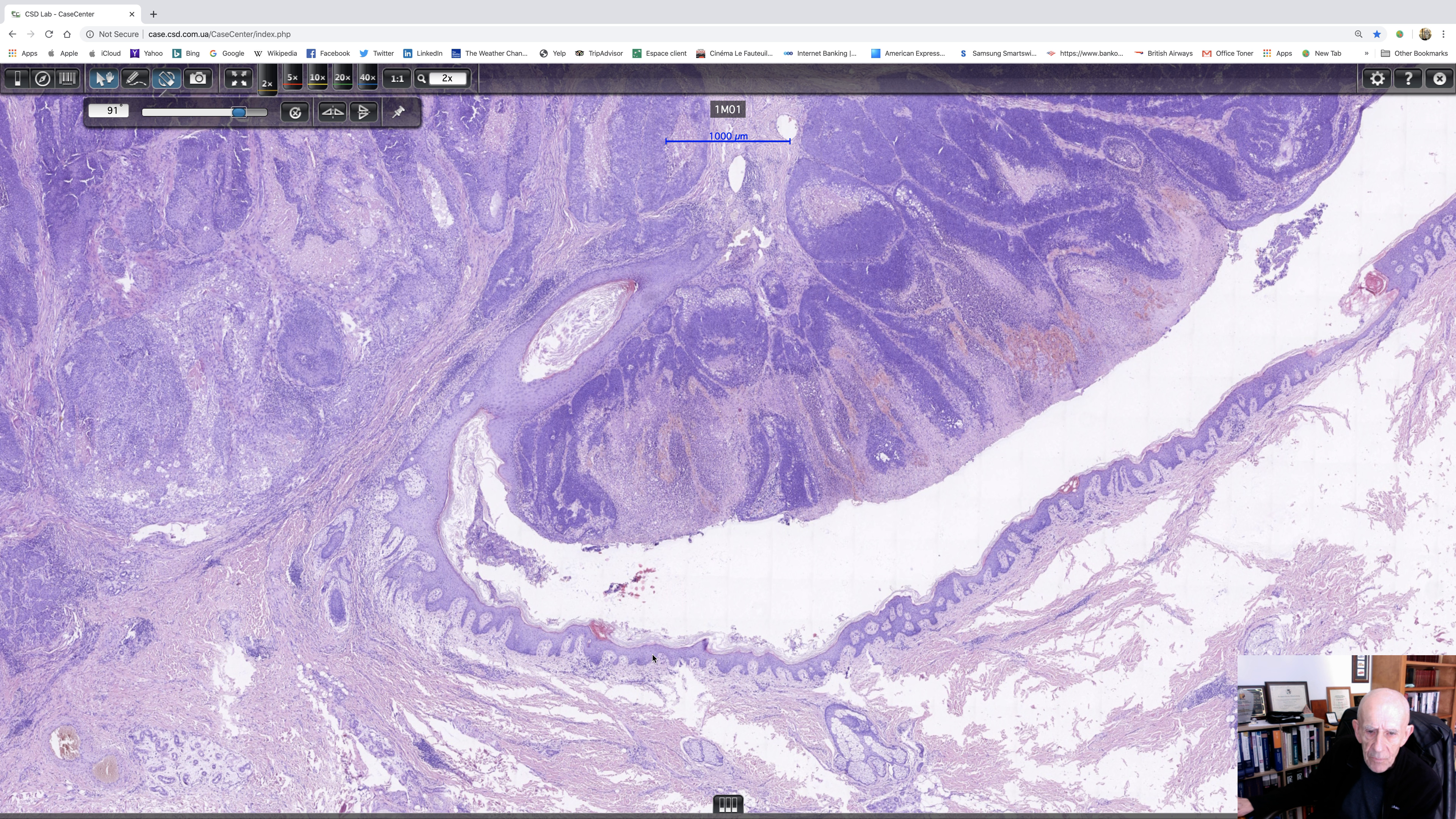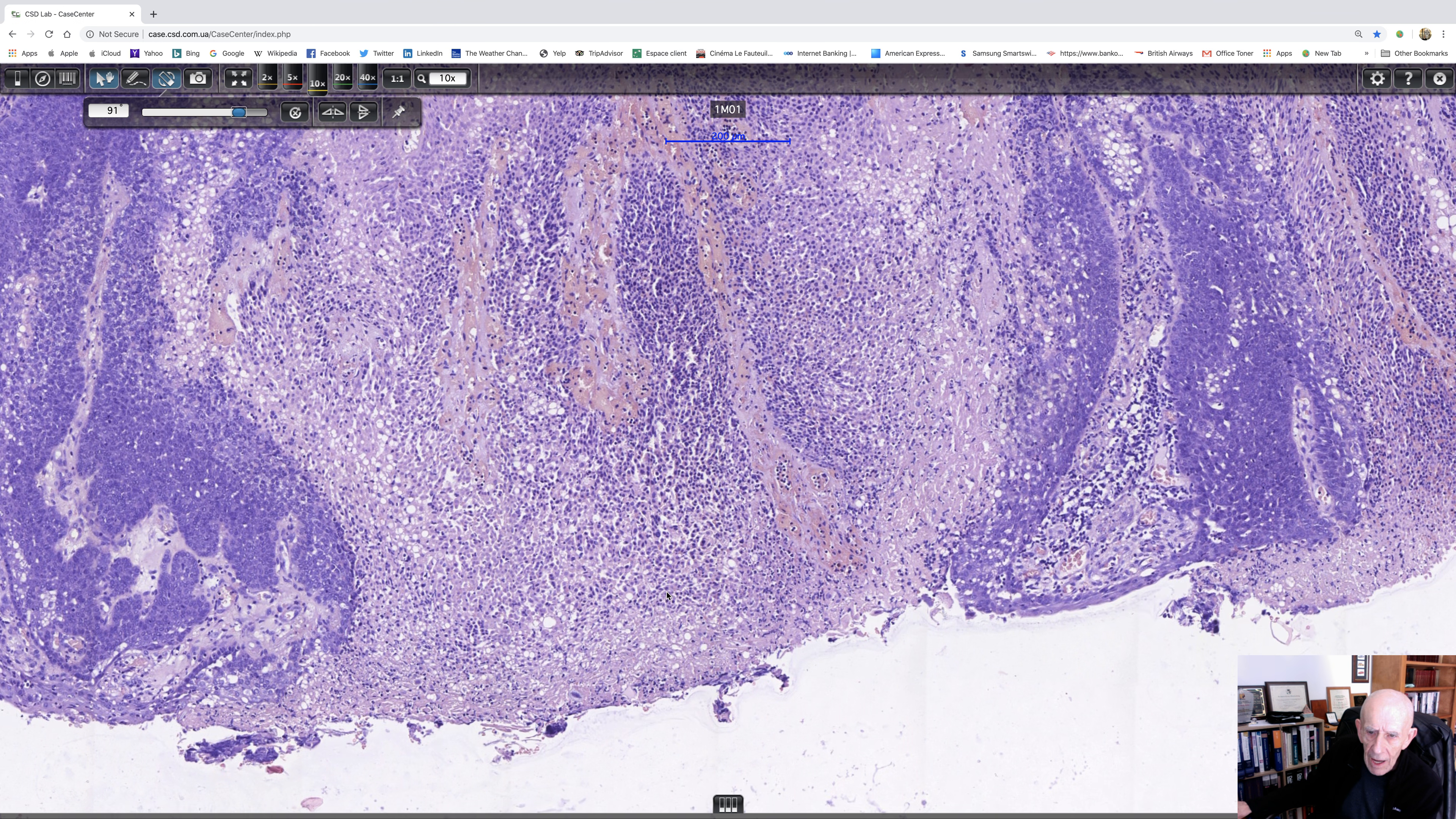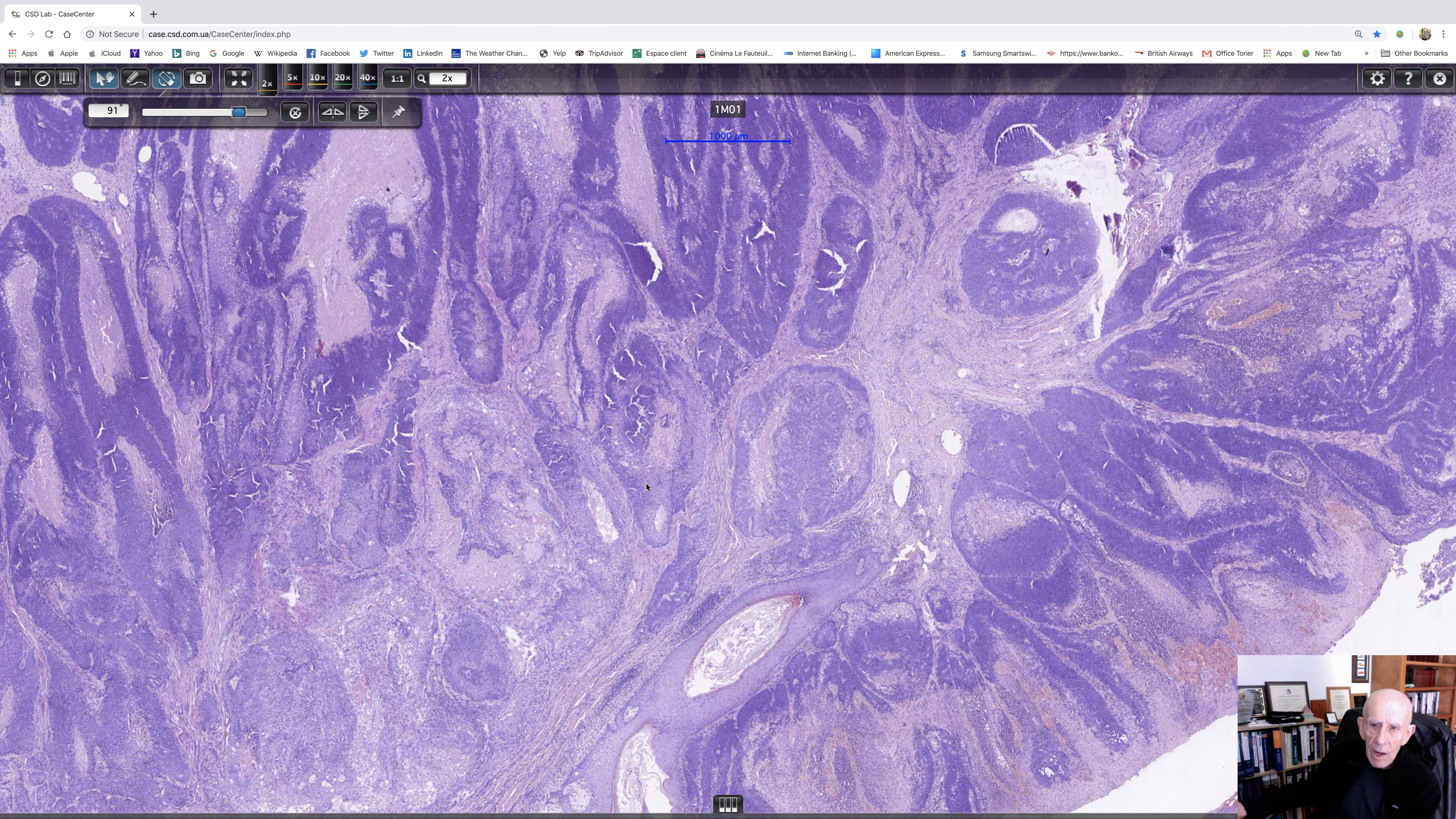So there's the non-lesional epidermis. And here you can see that there's a basaloid tumor. It looks as if it's showing multifocal origin from the epidermis, which of course is very obviously ulcerated. So let's go back to times two again. So we've got a basaloid tumor arising from the epidermis. So what things do we think of right away?